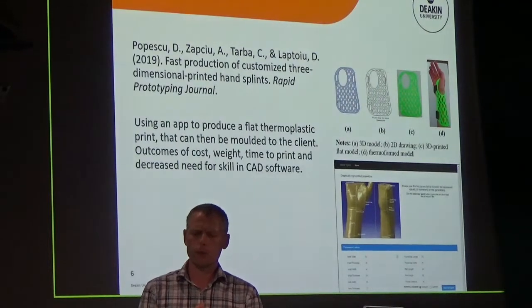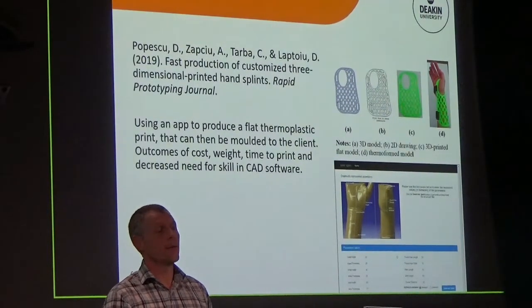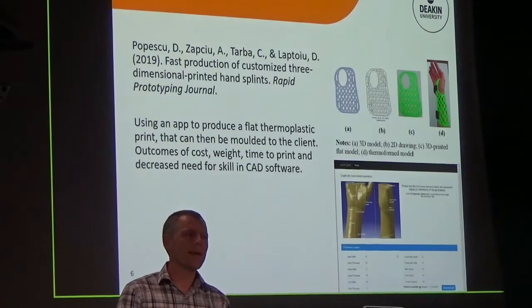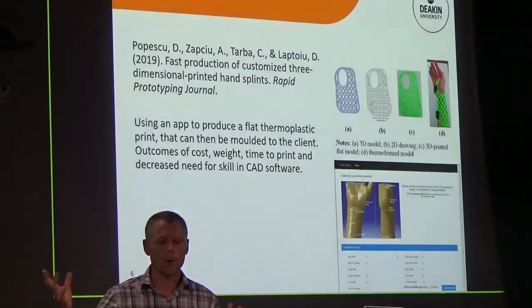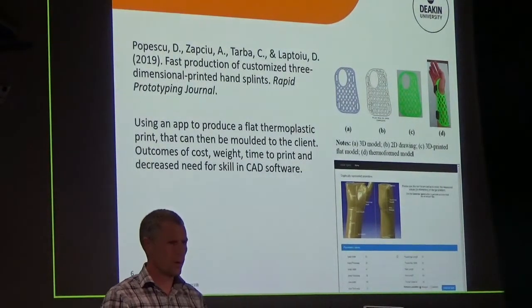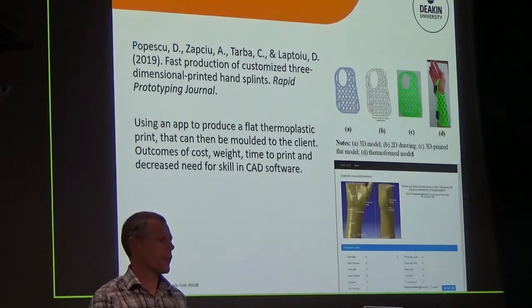Or another really interesting one, and this is thinking about the use of computer-aided design and printing and such, is that there is an app already out that you can either scan or put in numbers into a bit of software, and that will print out a flat piece of material. The flat piece of material has already got its insertion points for a thumb hole and for putting your Velcro straps through and things like that. So it is flat. It still requires the skill of the therapist to then go and mould it. So you end up with a splint that's been printed out, the green material, out of the printer, a flat piece, and then you heat it up and mould it.